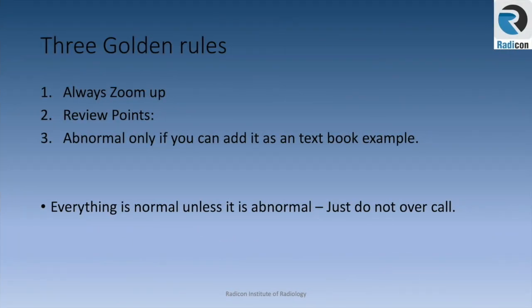Before jumping into image analysis, let me give you 3 golden rules of rapid reporting. If you follow these points, I can pretty much promise that you will pass this. Golden rule 1. Always zoom up. You will fail rapid reporting if you do not zoom up the image to look for the detail. Rule 2. Check your review areas. There will be several examples of review areas in this talk.